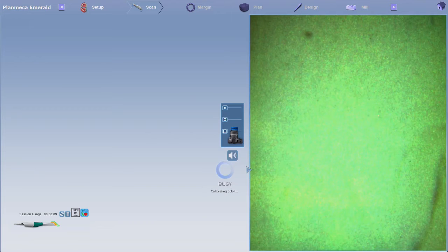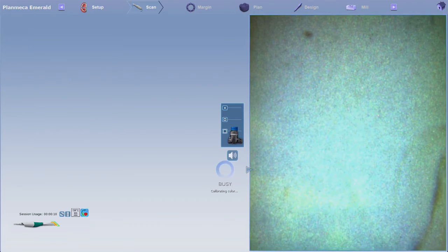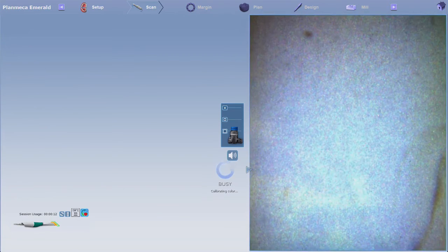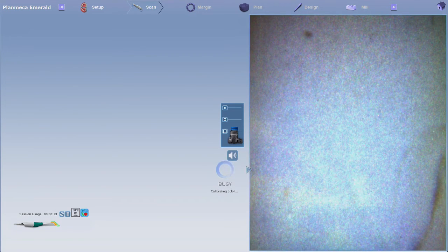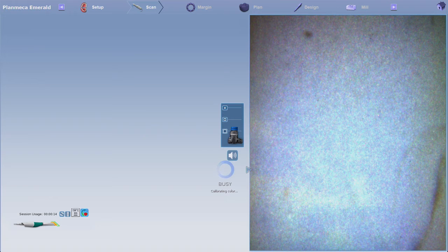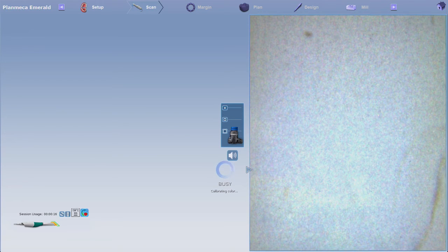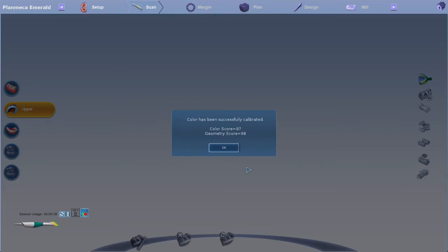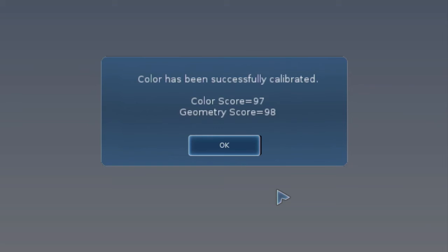Several colors will flash during the process. Once the calibration is complete, you'll receive a notification of successful completion. Click OK to continue.